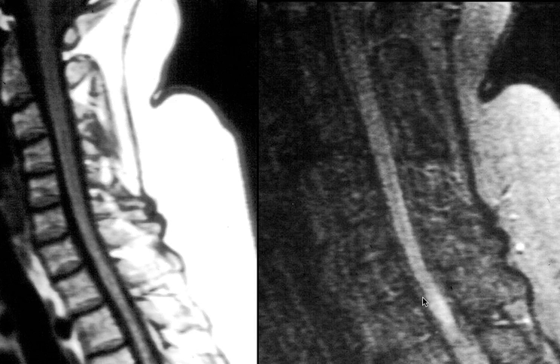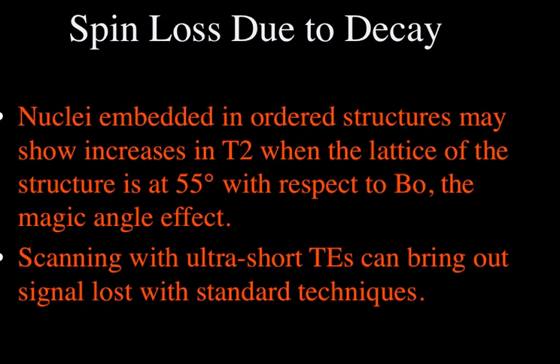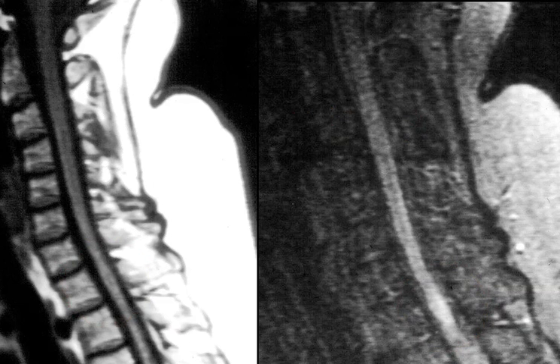This sequence on the right took about 18 minutes to acquire back in those days, and that's why you see the motion artifact. On T1, we don't see much in the cord. On the T2, we can see a nice lesion from MS here in the cord, even with these old-fashioned image quality scans. That's an old, regular spin echo T2.